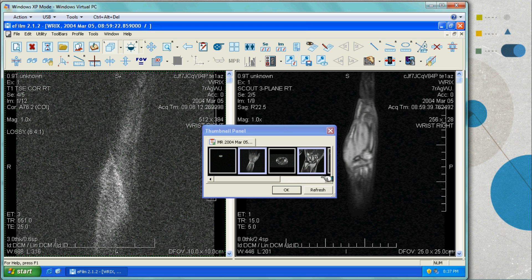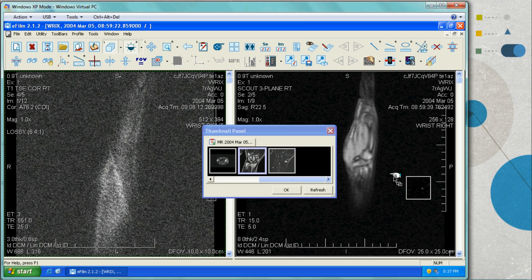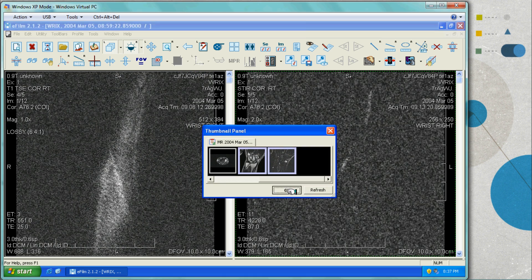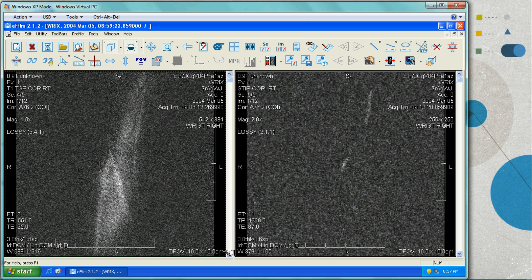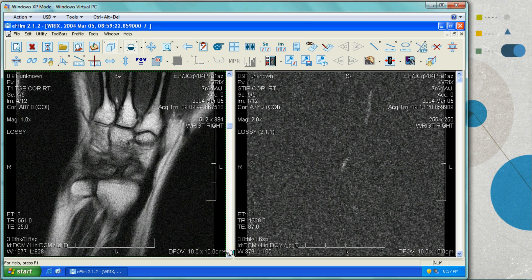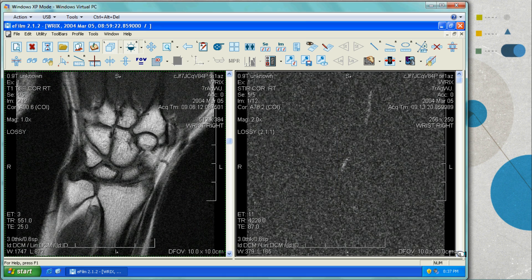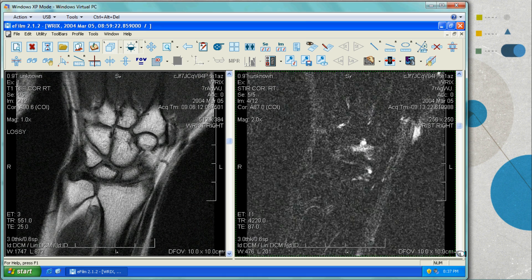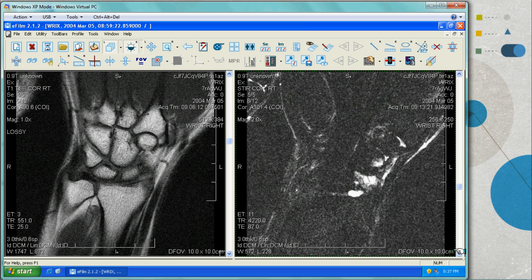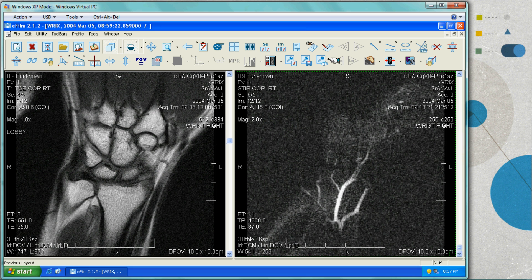Now the doctor will manipulate their images and get ready to interpret the film. They use all their normal tools as they usually would in eFilm.